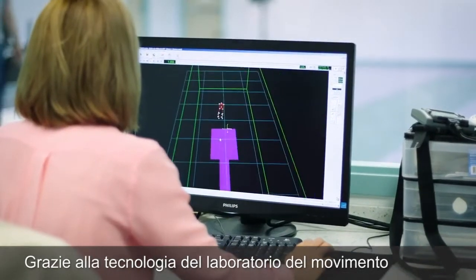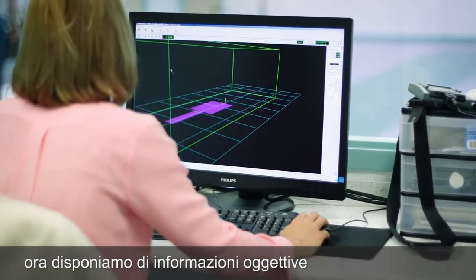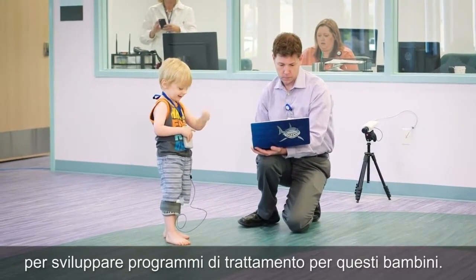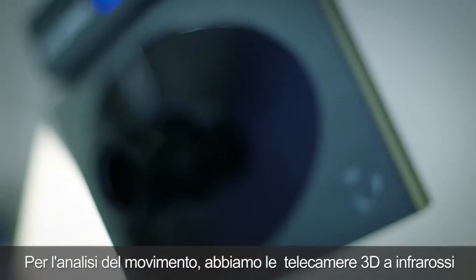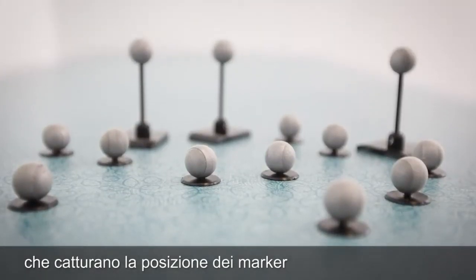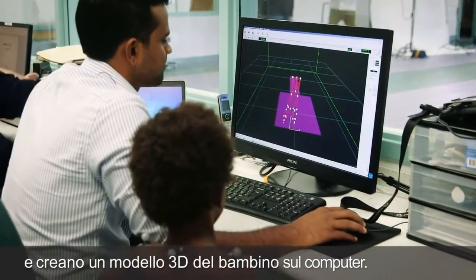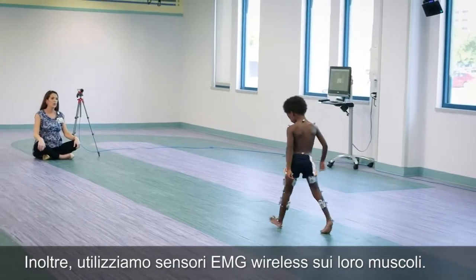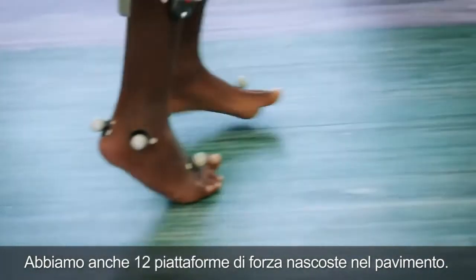Because of the technology in the motion lab that's been provided for us by our donors, we now have objective information to develop treatment plans for these children. For movement analysis, we have our 3D infrared cameras that pick up our sensors and that simulate a child in a 3D image on our computer. In addition to that, we use wireless EMG sensors on their muscles. We also have over 12 force plates hidden in the floor.